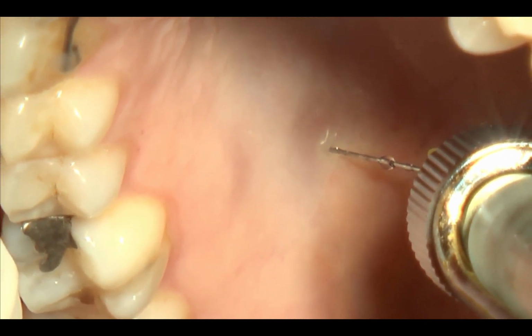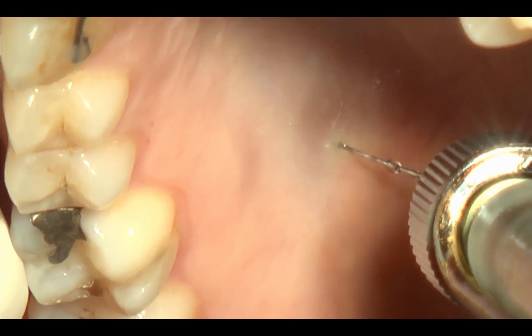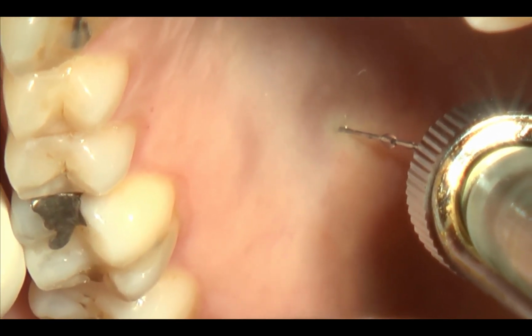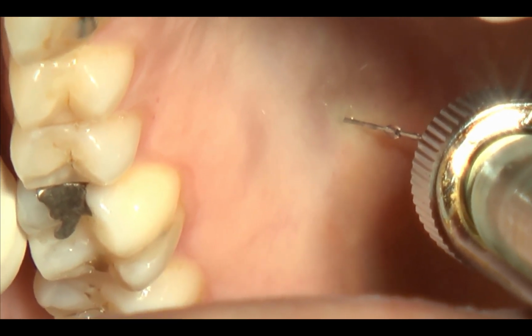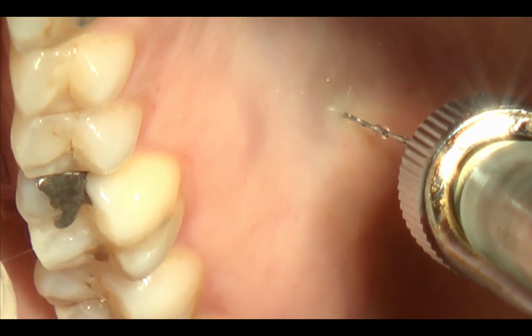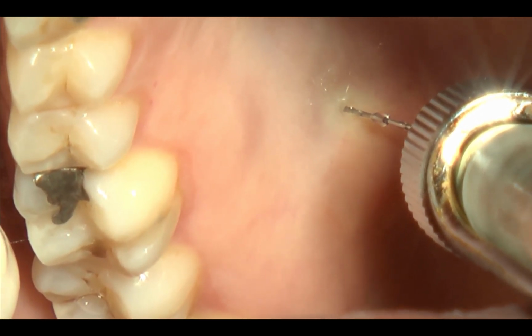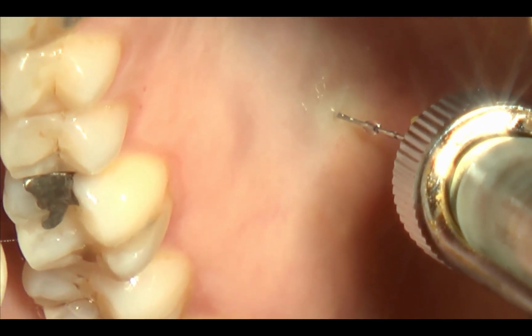You see that in this area where the soft tissue of the palate is completely soft, there is no pain during the spread of the liquid, while if you make anesthesia in the area of the dense fibromucosa of the palate, especially in the area of the 7 of the 8 where we are going to take our graft in this patient, this is extremely painful because of the presence of very dense collagen-rich connective tissue.